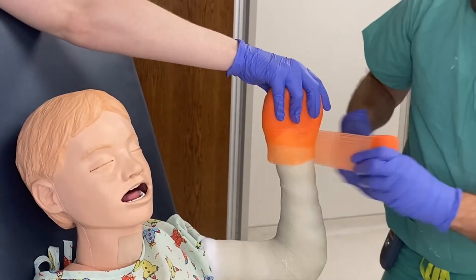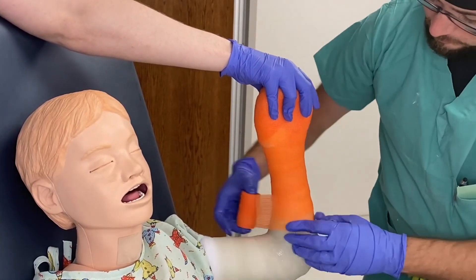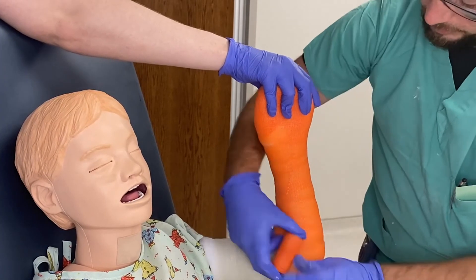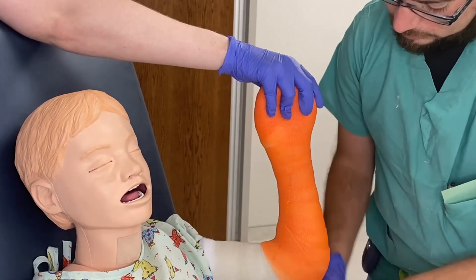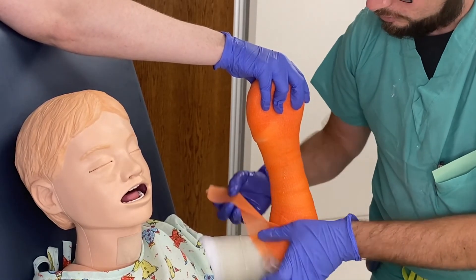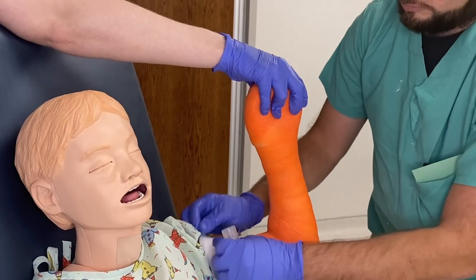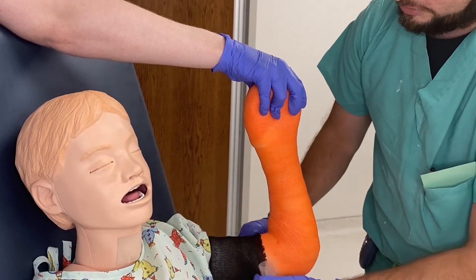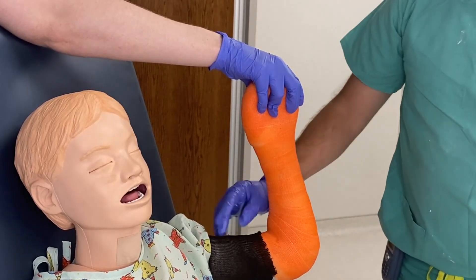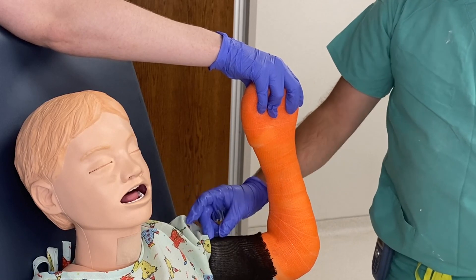Coming down 50-50, about the ballerina spot 50-50, about the ballerina spot 50-50. Roll back the stockinette just to make sure, then fill it up and finish with the rest of the color, making sure it's all nice. Don't come right to the edge — you want to see at least a quarter to a half inch of stockinette showing. And that is the long arm mitten cast.